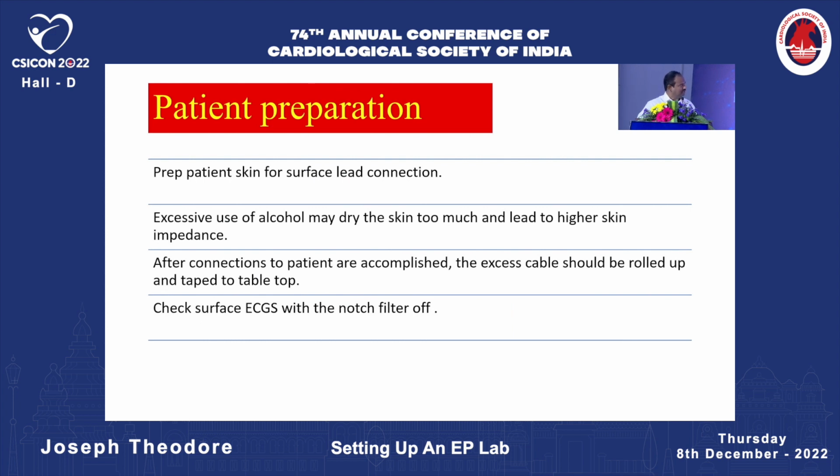It starts from the patient. Prepare the skin for the surface lead connection. Do not use excessive alcohol because it might sometimes lead to increased skin impedance. After connections to the patient are established, the excess cable should be rolled up and put on a tabletop. It should never be lying over the floor or going across, touching the floor. Check the surface ECG with the notch filter off, because the notch filter is mainly for the AC current noise which would come into play. Many times you switch off the notch filter and check if there is a broad noise present, or sometimes you need to switch on the notch filter. This is not mandatory all the time in many of the labs.